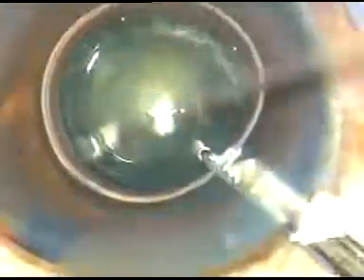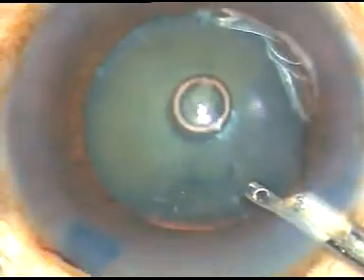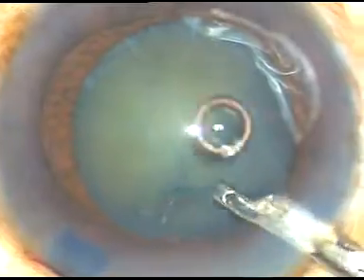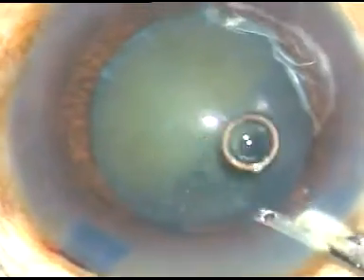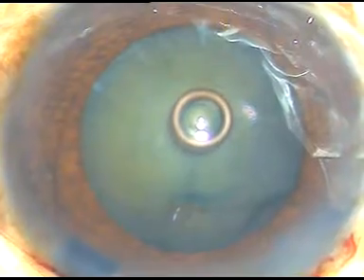The dye is sprayed over the anterior surface of the cataractous lens, and after 5 or 6 seconds the dye is washed out. We can see some flaps on the anterior capsule. Probably those are pseudo-exfoliated material.